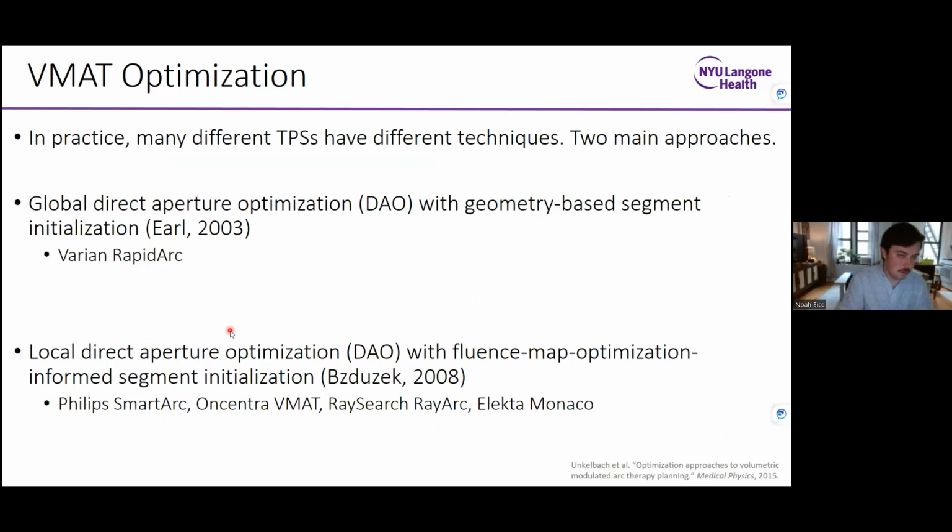Different treatment planning systems will have different approaches to VMAT optimization, but there are two main ways that it's been implemented commercially. We'll just talk about each of them pretty briefly. They're both a mouthful, and it's not really important to know the terminology, but we'll go through it.